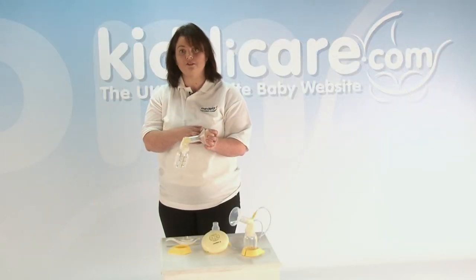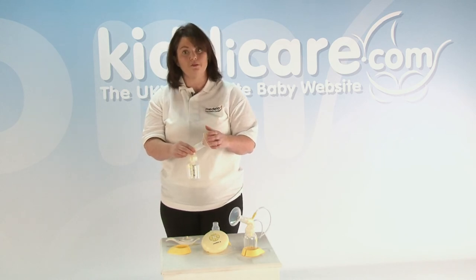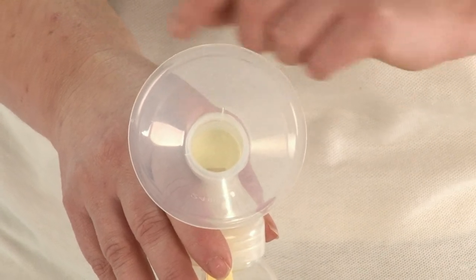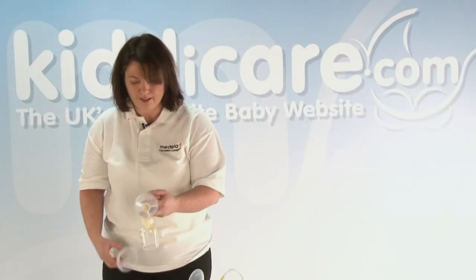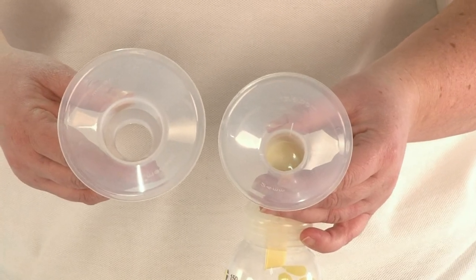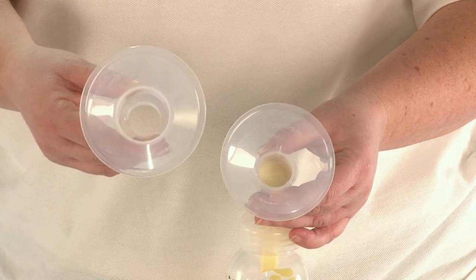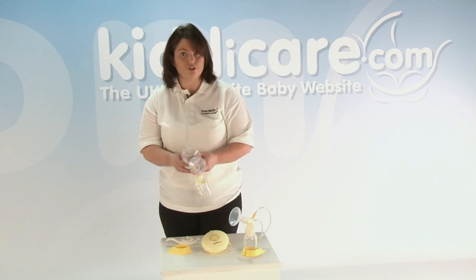Now, Medela have a personal fit breast shield available. The one that you have with your breast pump will be the medium, which is a standard 24mm shield. And that's the diameter here, this little bit across here. So again, you're looking at this nice free movement of the nipple in and out. Because if you think about it, if you fit into that, that's fine. But if you need a shield that size and are trying to squeeze into that, then you are going to get sore. So Medela do have a personal fit, all the way from small, medium, large, and extra extra large, which is this one. So we hope we'll be able to provide you with a solution that is comfortable for you.